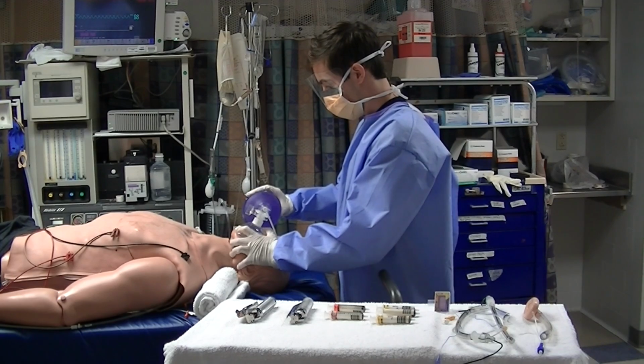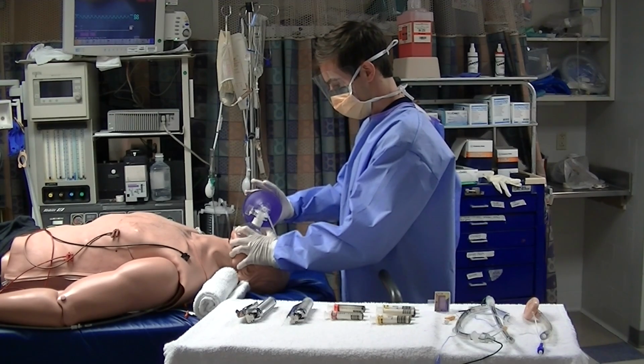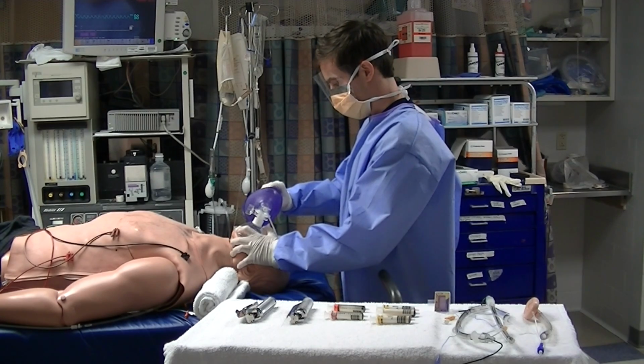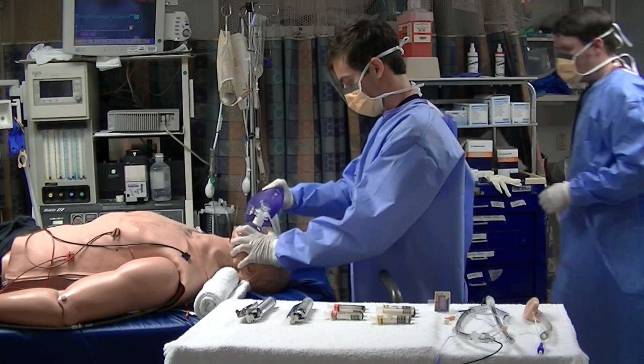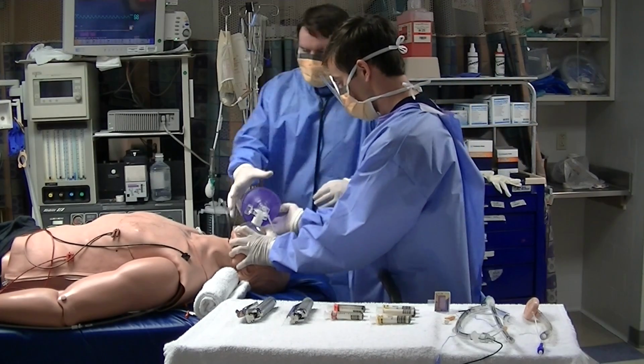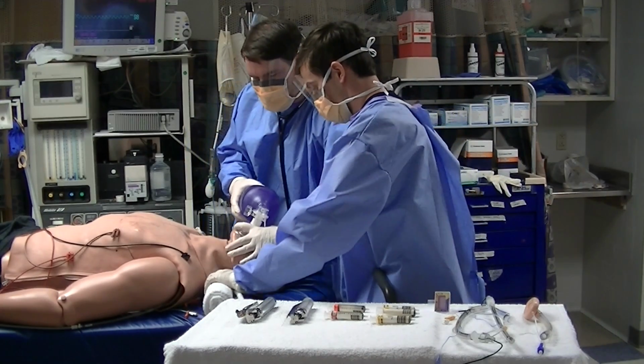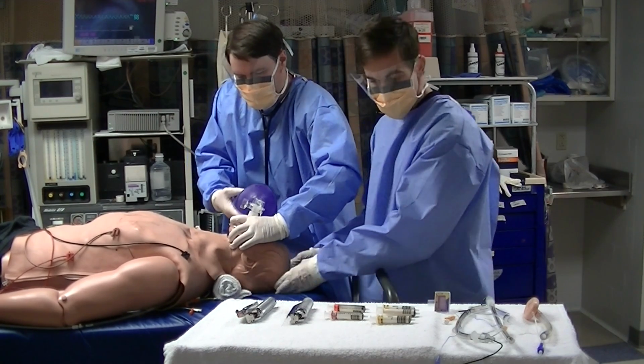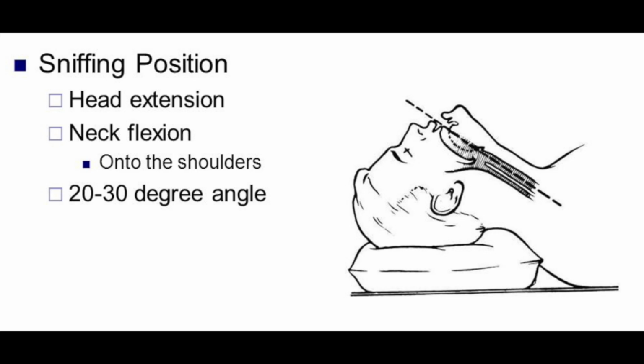While not clearly demonstrated in this video, the practitioner is using nasal cannula in addition to his bag valve mask to ensure adequate pre-oxygenation of his patient. He has all his necessary equipment within arm's reach and even has an assistant who will now help pre-oxygenate the patient. Note how the provider uses a rolled up towel to place the head in the sniffing position, which helps to minimize airway resistance and get a better look at the vocal cords.